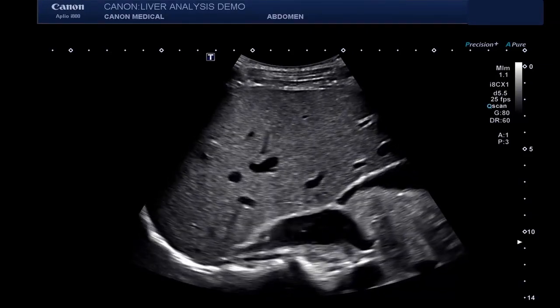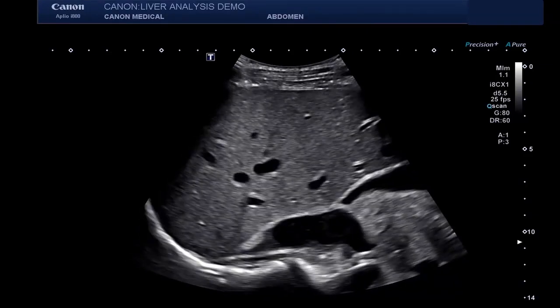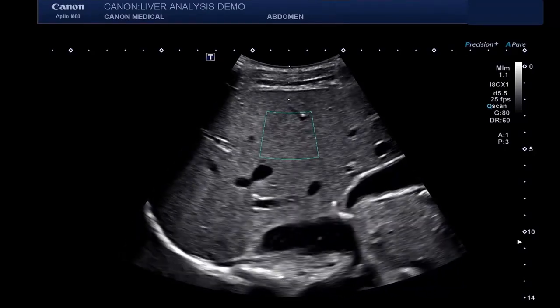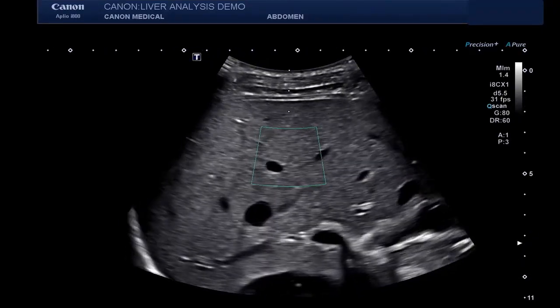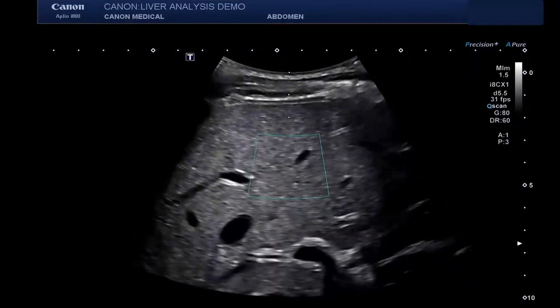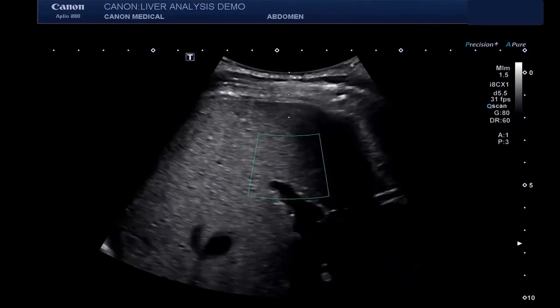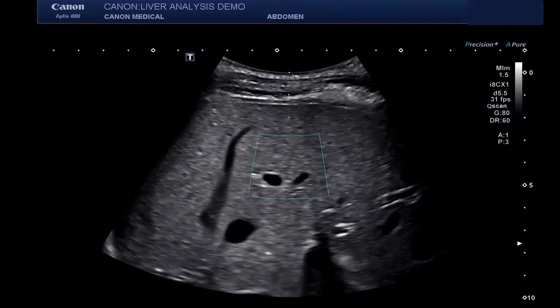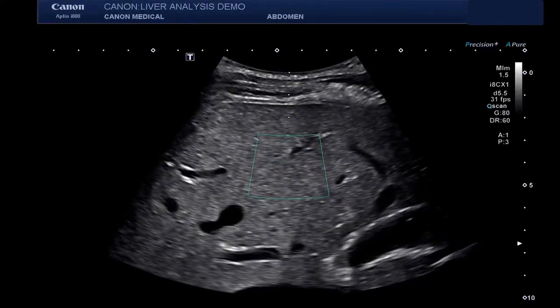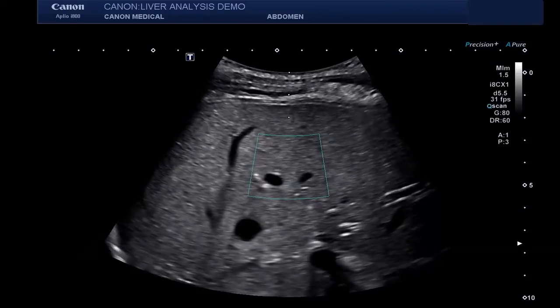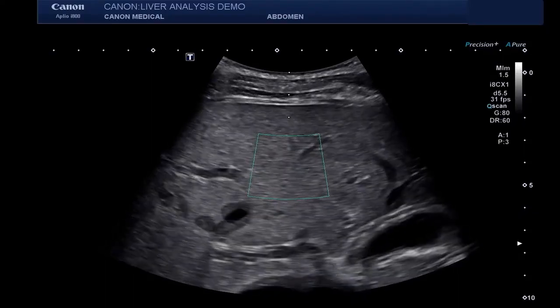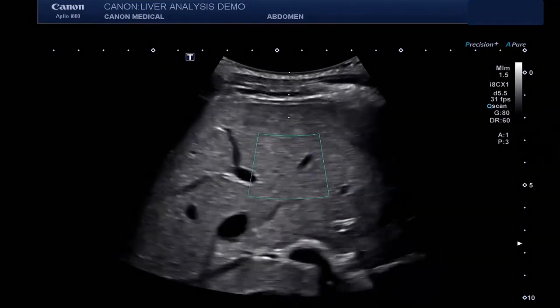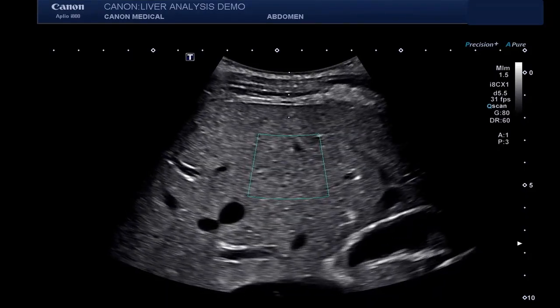Let's start with liver shear wave. To begin, the patient should be placed in a supine or slight left lateral decubitus position with the right arm reached over the head. We'll be scanning the right lobe of the liver in an intercostal acoustic window, taking care to avoid shadow artifacts and large vessels in the portal trunk.